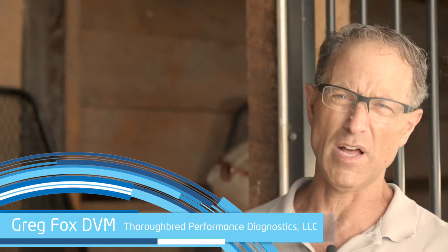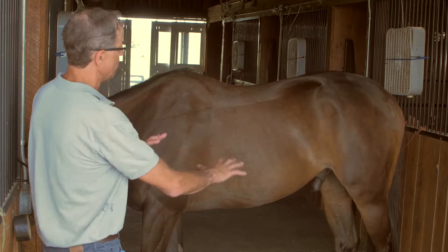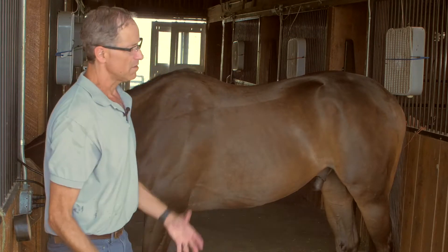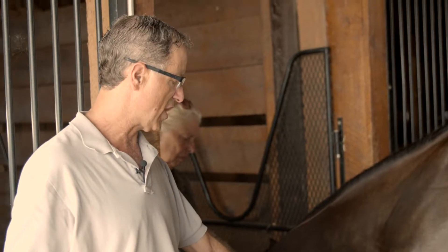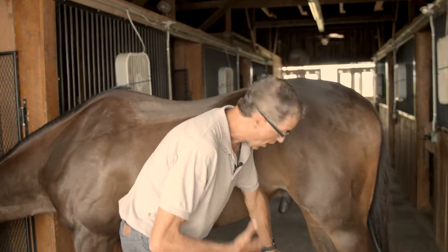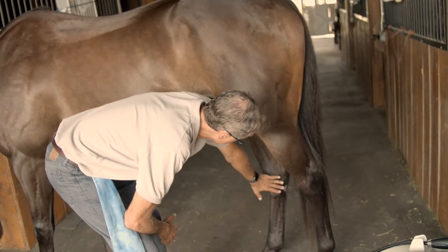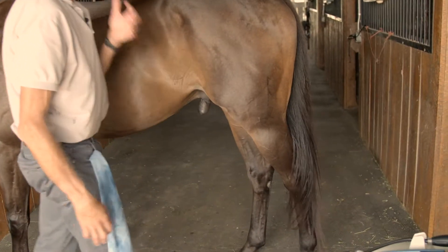I've given him a little bit of tranquilizer — 0.2 Dormo Sedan and 0.2 Torbugesic. He's a very sensitive horse to tranquilizers. When I start working below the hock or the knee, while I know there are times I've been able to treat horses without tranquilizing, we're gonna make this easy. Now I'm going to demonstrate how I treat the hock and high suspensory area in the horse.